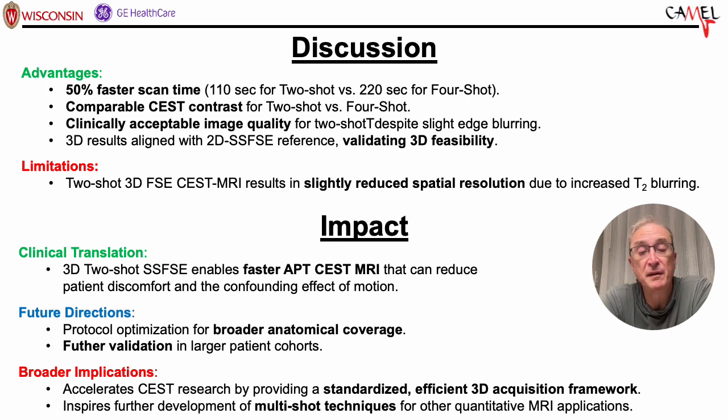In future directions, we're looking to do more protocol optimization for broader anatomical coverage and further validation in a larger patient cohort. And broader applications or implications, well, having a standard efficient 3D acquisition framework on a GE scanner for CEST MRI opens the door to new possibilities.